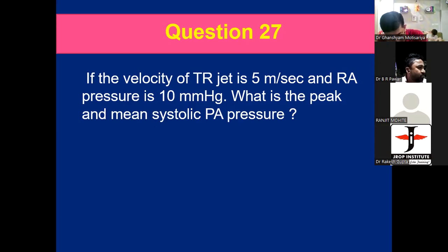0.6 into 110. Correct. And plus 2.1. Correct. Good. Now you will not forget it ever in your life. Yes, sir. Thank you.